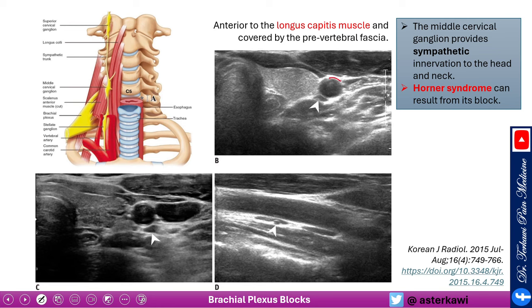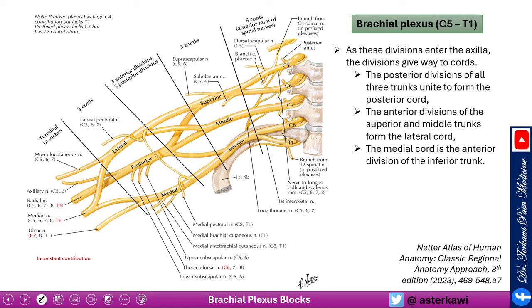On ultrasound, the carotid is visible, and behind it you can see the thyroid. The middle cervical ganglion can be identified in longitudinal views as well. The clinical relevance is that if you inadvertently block this ganglion, you may get Horner syndrome, which we'll discuss shortly.